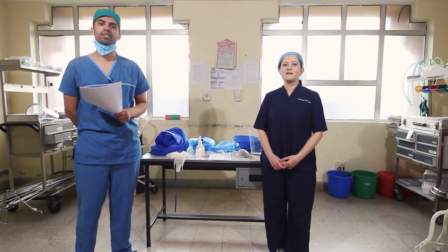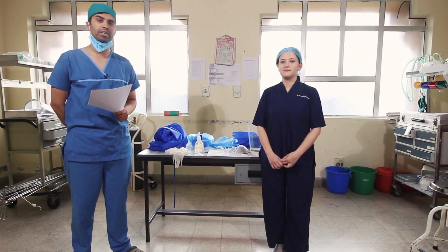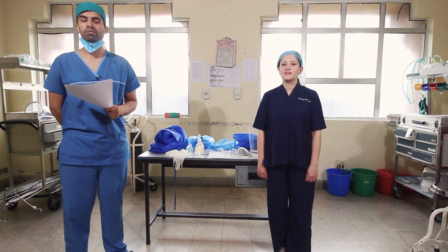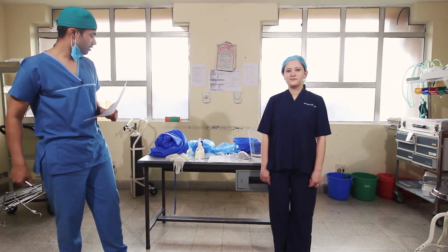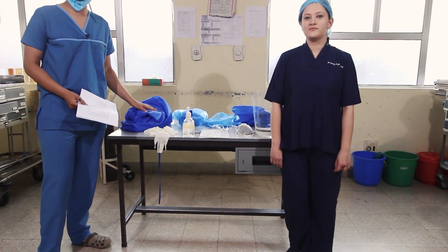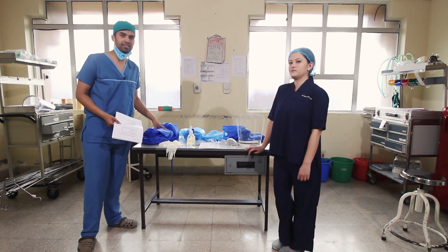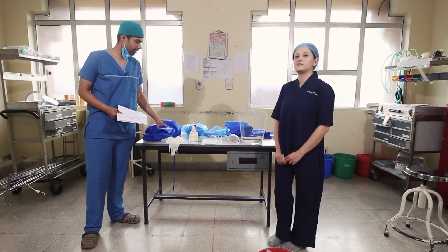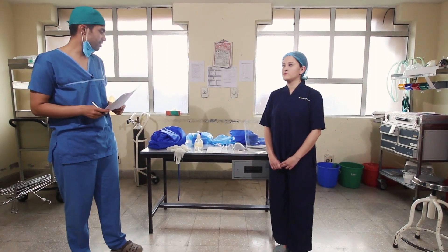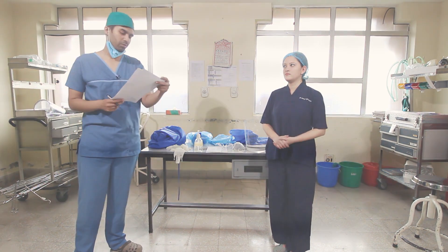Hello, I am Dr. Ajit Jaa. We are junior residents from the Department of Anesthesiology at BPKHS. Today we have made this video to demonstrate the steps of donning a personal protective equipment. This is a PPE that we have devised from local resources. This is not a standard PPE, but in a scenario of shortage we have designed this, and it is supposed to replace normal surgical gowns. She will be donning and I will be doing the checklist and helping with the donning process.